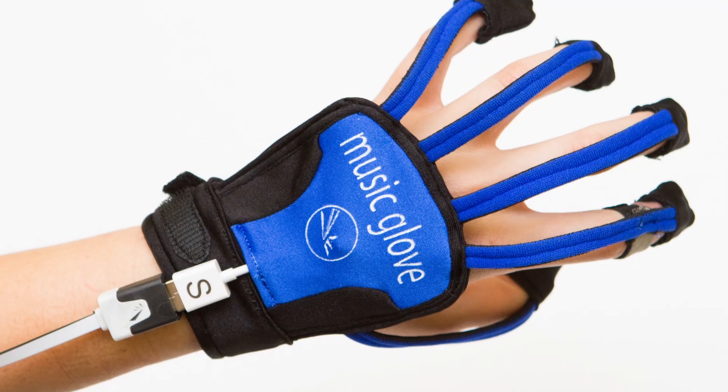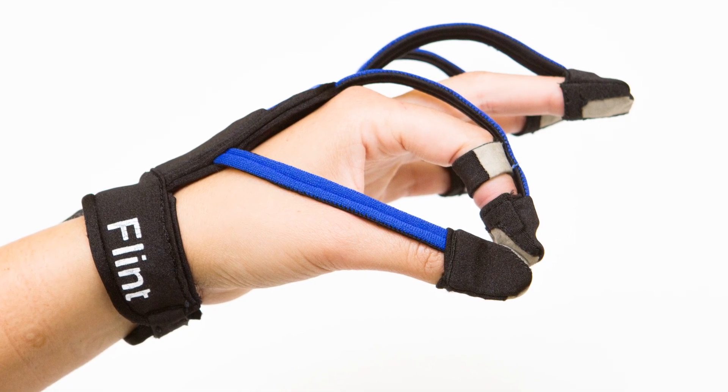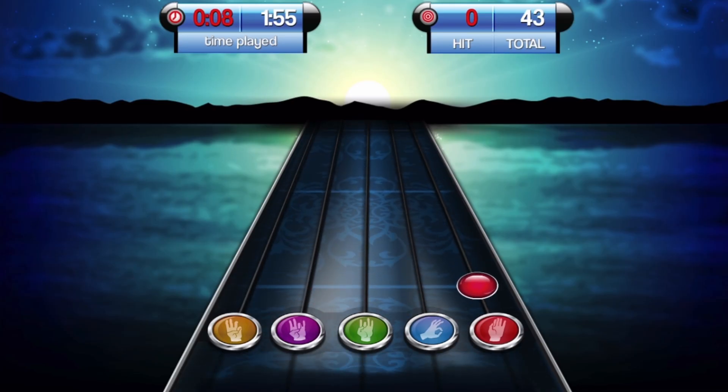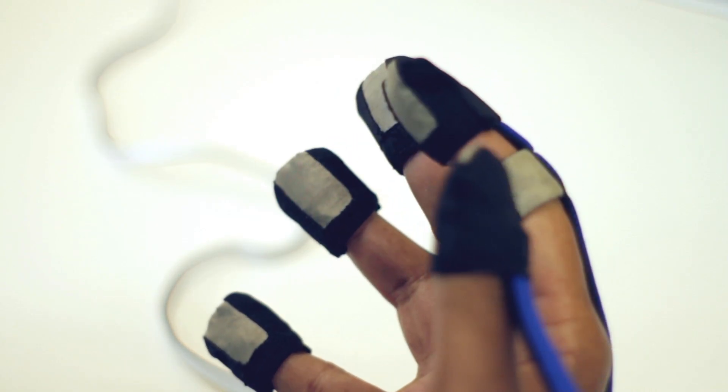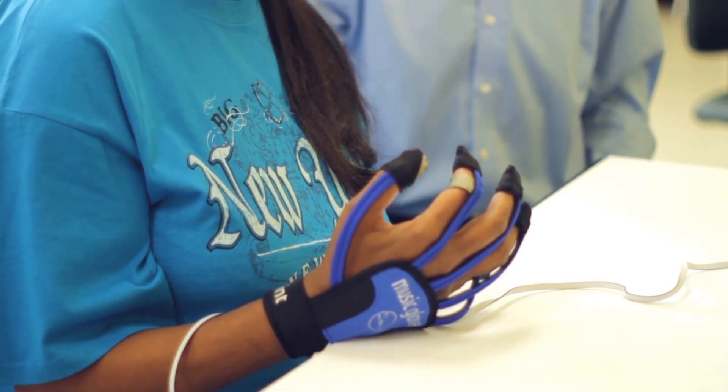Music Glove is a device you can wear on your hands, and it will help you recover hand movement ability if you use it to practice movement. It senses when you make different grips, like a key-pinch grip or a pencil grip, and then you use that to play a really engaging musical computer game. So you're essentially practicing these grips and playing music as you do it — a very engaging way to get better at moving your hand.